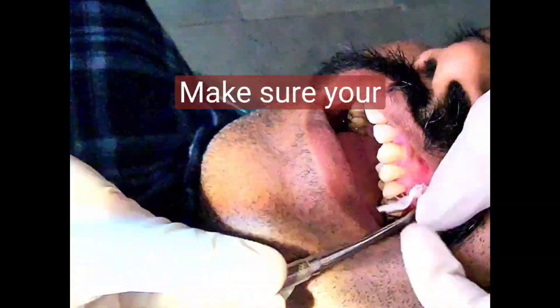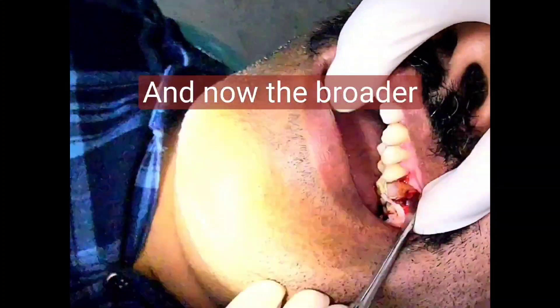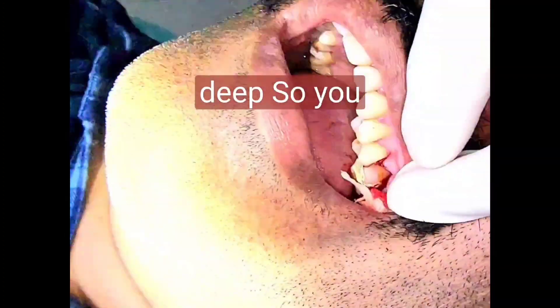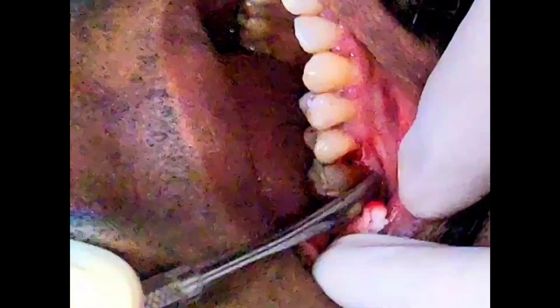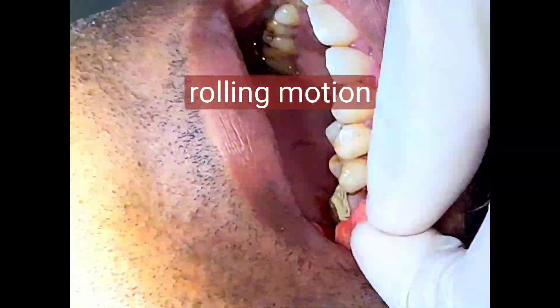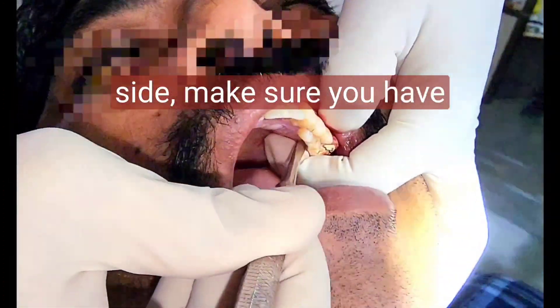Make sure your other hand supports the flap superiorly. Now the broader end will reflect it even higher and deeper. You start with the pointed end and then finish with the broader end. The main motion here is a rolling motion — roll like a pan. This was the buccal side. Now for the palatal side, make sure you have taken proper rest.